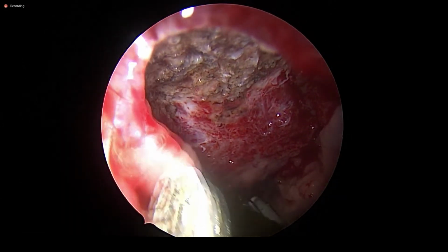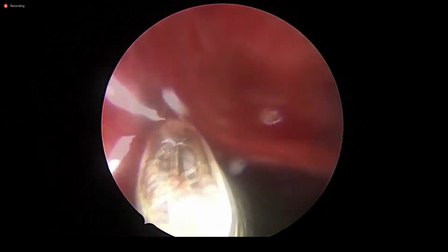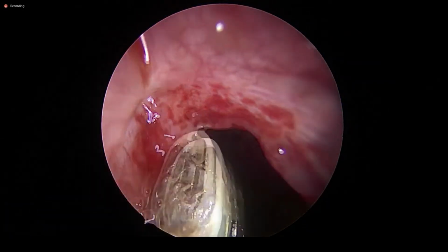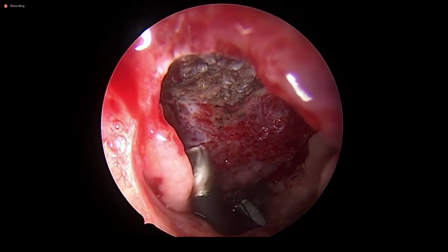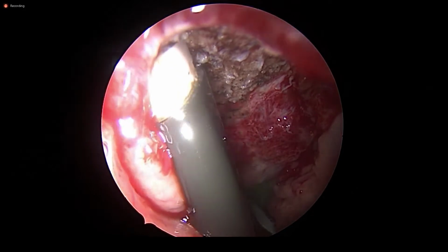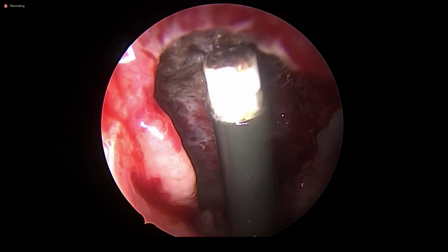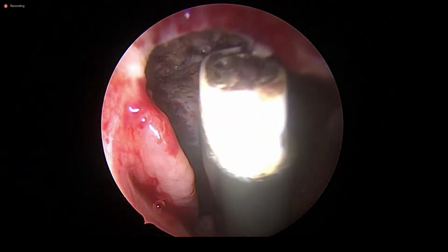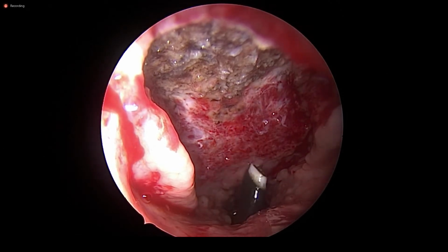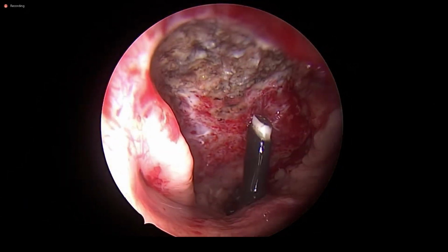See this carpet coagulation. This is the Eustachian tube orifice. This is the Eustachian tube per se. We are not supposed to damage the Eustachian tube. This is the torus. This is the Eustachian tube orifice. The beauty of endoscopic adenoidectomy is that we do it under vision and we can protect these structures very efficiently. So this is carpet coagulation of the periosteum layer. This is oropharyngeal mucosa, this is nasopharyngeal, perimysium and the muscles behind.